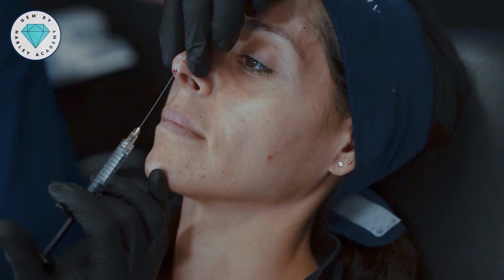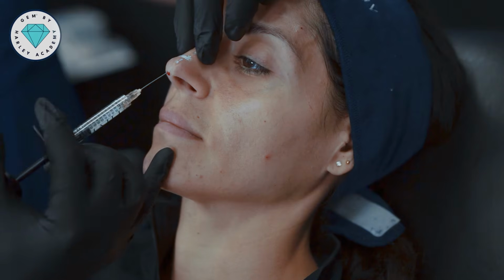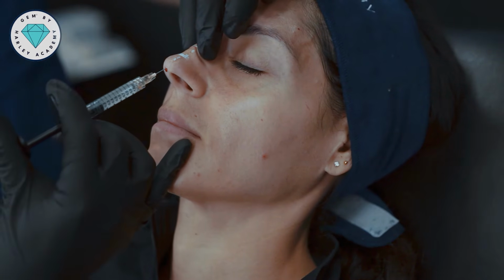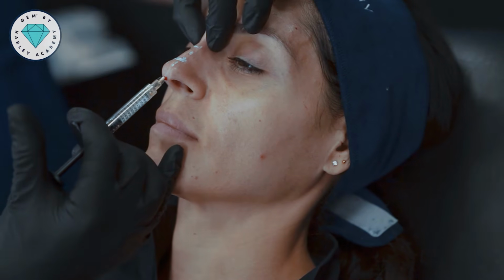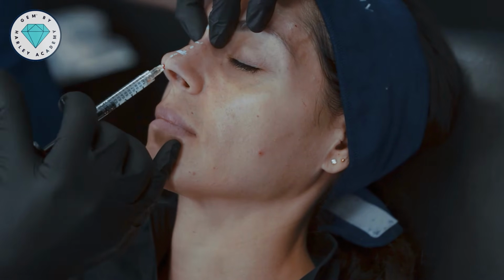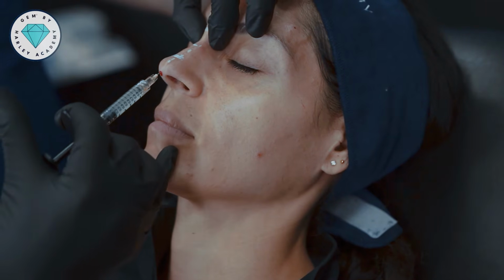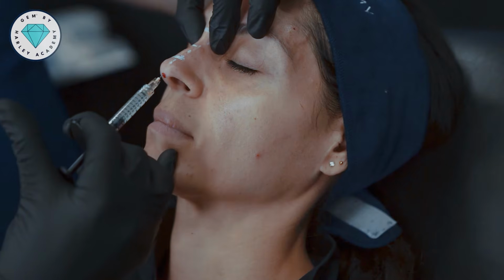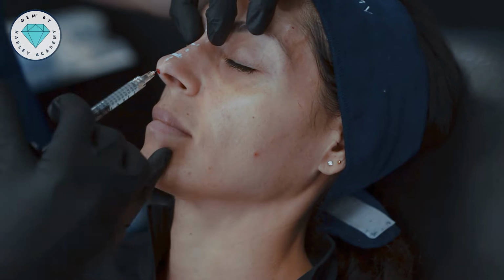I'm now going to continue all the way above the dorsal hump, staying in layer 4, underneath muscle. And here we're going to need a reasonable amount of volume to project above that dorsal. But I'm going to keep the cannula moving as I add my volume. Comfortable?